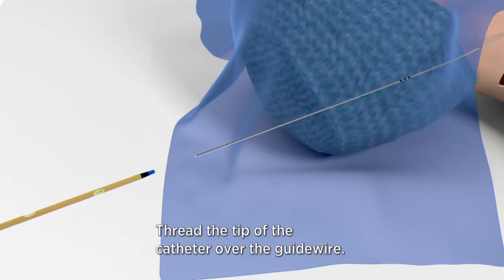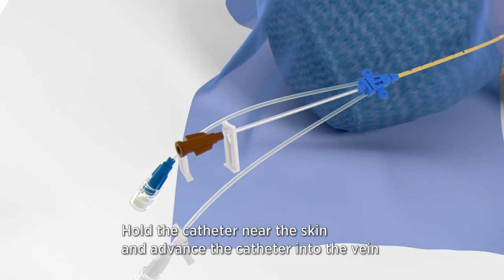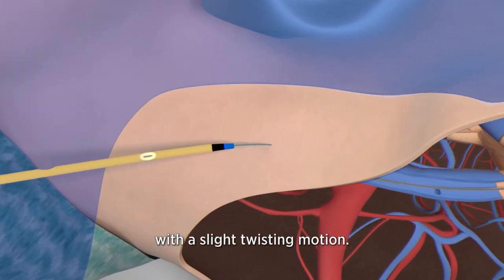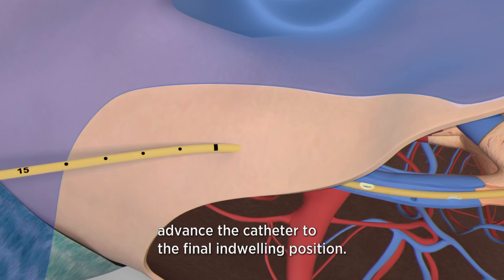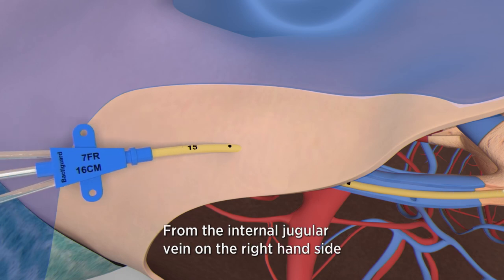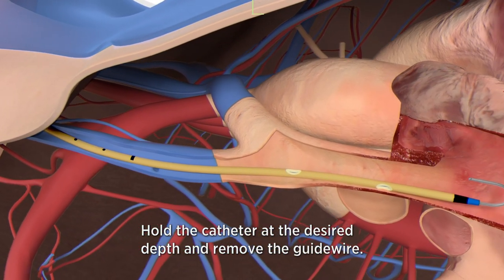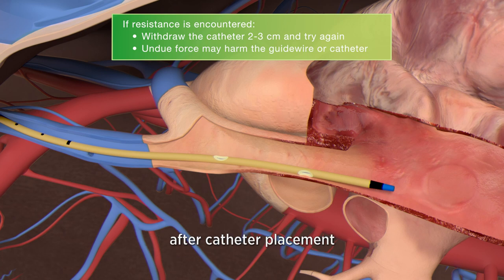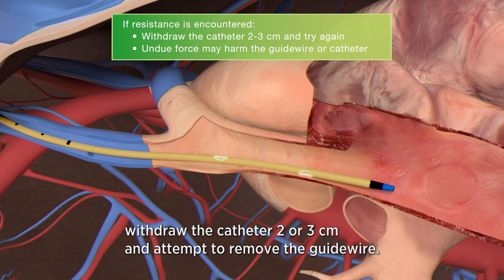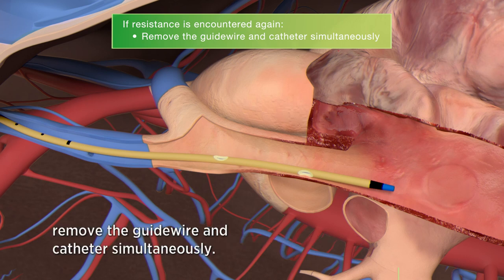Thread the tip of the catheter over the guide wire. A sufficient length of the guide wire must remain exposed at the brown hub to allow a firm grip. Hold the catheter near the skin and advance it into the vein with a slight twisting motion, using the centimeter marks as positioning reference points. From the internal jugular vein on the right hand side, it is approximately 15 centimeters to the target position. Hold the catheter at the desired depth and remove the guide wire. If resistance is encountered when removing the guide wire, withdraw the catheter two or three centimeters and retry. If resistance persists, remove the guide wire and catheter simultaneously.